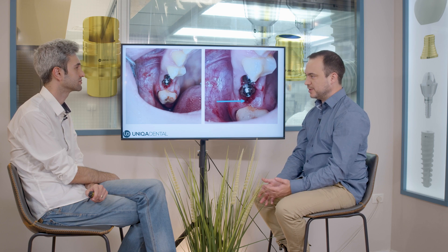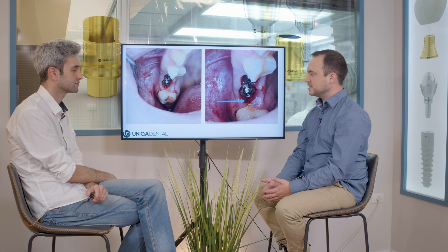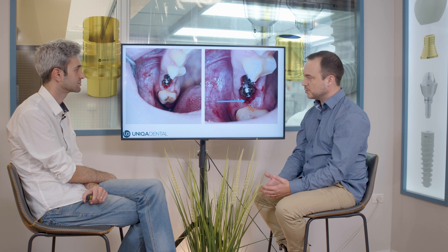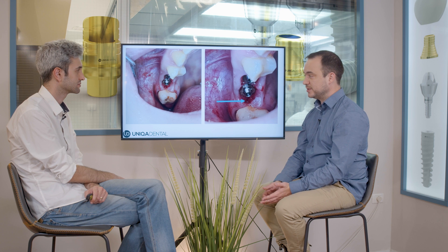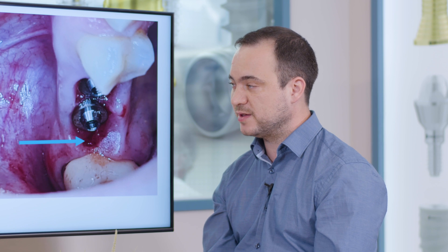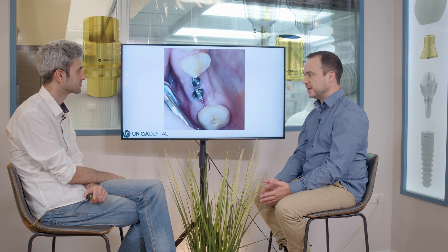When you have some inflammation, you need to react immediately. You take out the crowns and give it a little bit of time to heal up. In this case, we took out the crowns and gave it about two days. The result of the healing was amazing — these are the same multi-units after two days, and you can see they're almost completely pink.